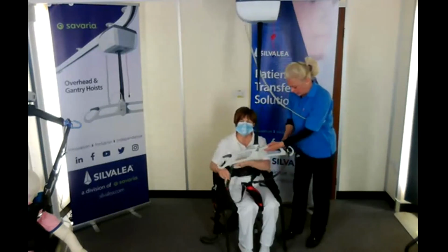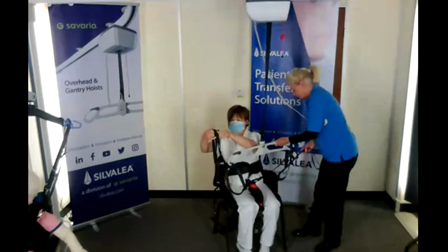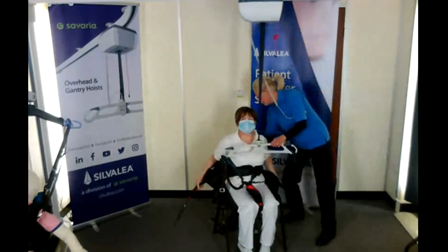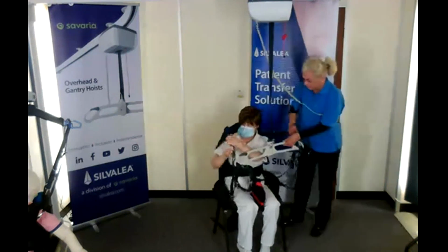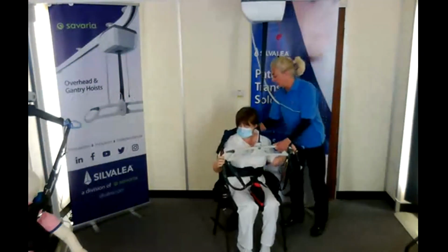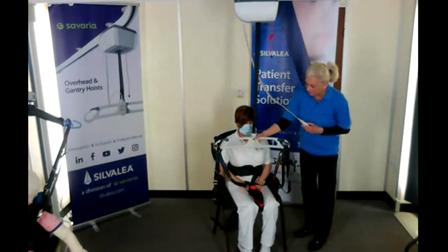So let's go, just build it slowly. We'll go from the legs. So we're going on the green leg, two hip tapes, the shoulder tape. So this is going to wrap around the shoulders and help protect. I'm not going to attach the head support just yet.